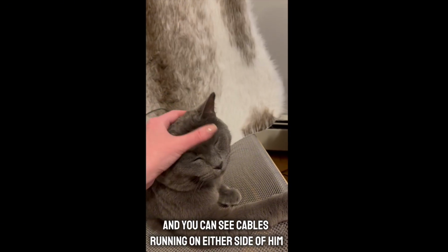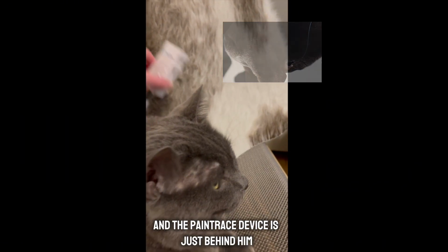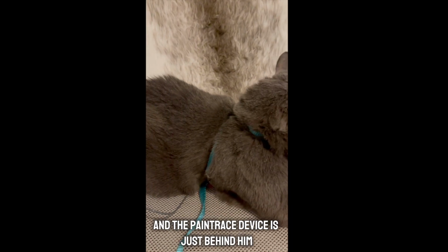Right now, he is hooked up to the PainTrace device, and you can see cables running on either side of him, and those are attached to sensors that are placed within the axilla, and the PainTrace device is just behind him.